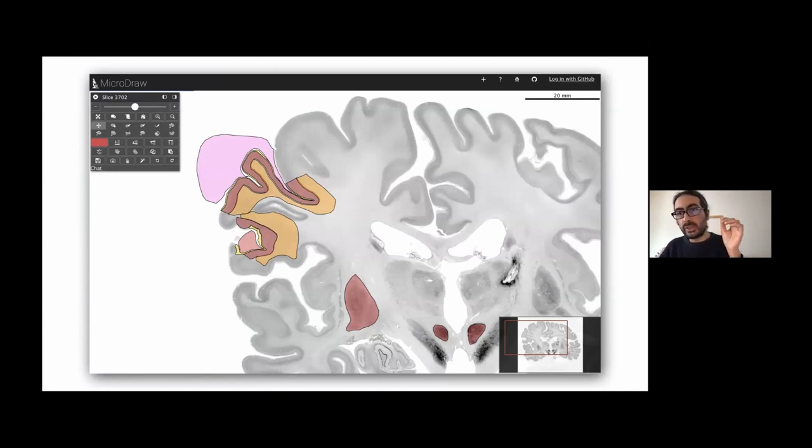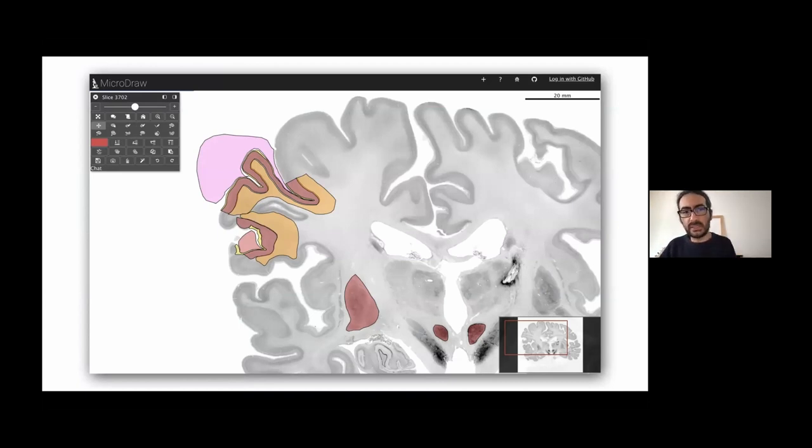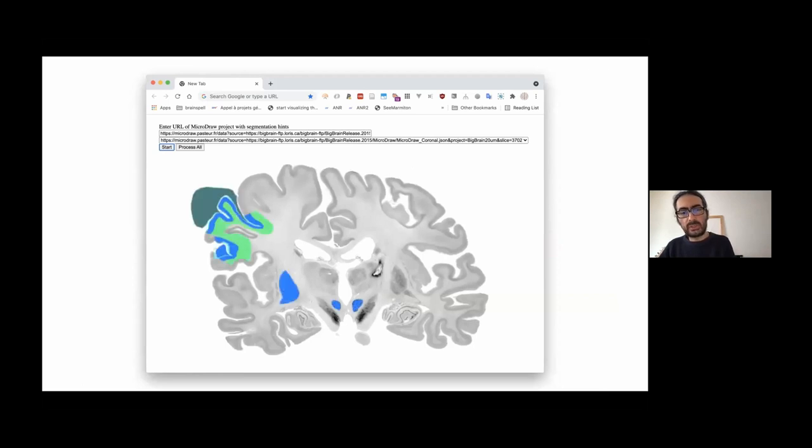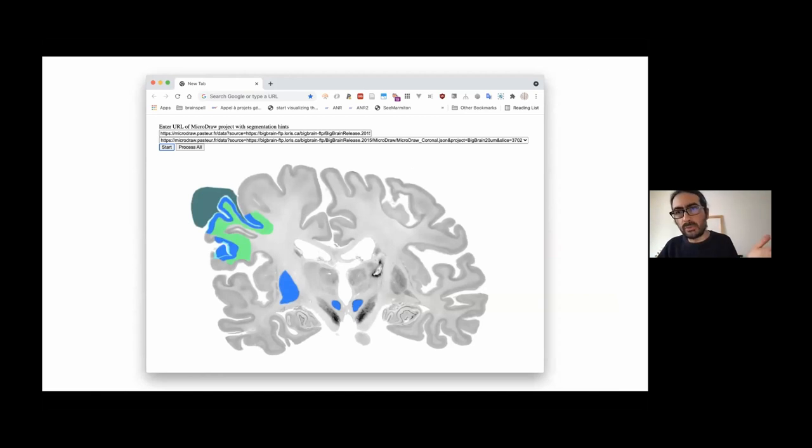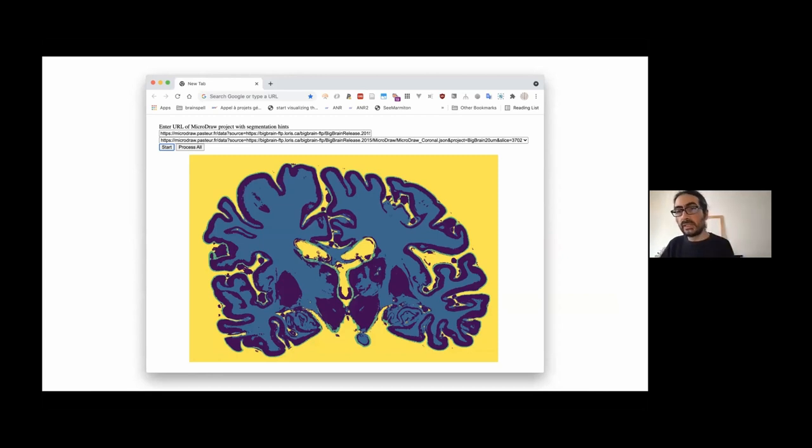Then the trainable segmenter will extract a vector of features for each of the voxels. And then based on that and the classes that you've just indicated, it will try to guess. So here it's our prototype actually running. So it queries one slice, it queries the annotations, and then it runs for about six to 10 seconds. And it produces segmentation based on the classes that you indicated.